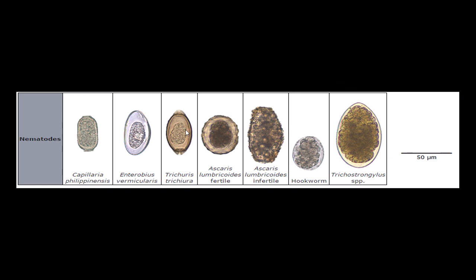And of course, from stool analysis, Ascaris lumbricoides, a very large number of eggs that has an albuminous material on the surface of the ova, elliptical in shape. It is pathognomonic.